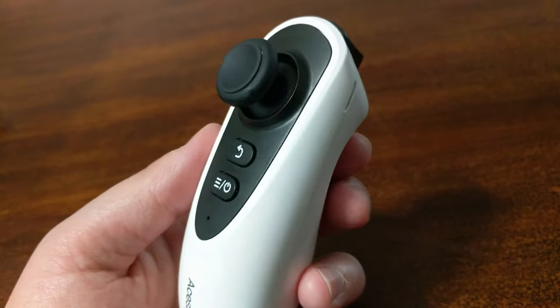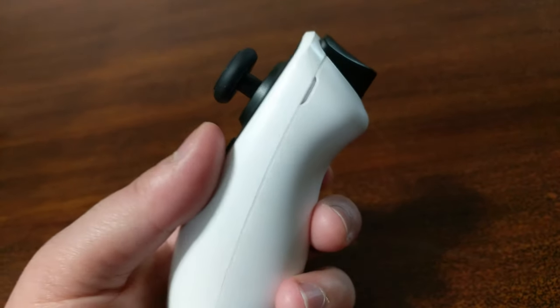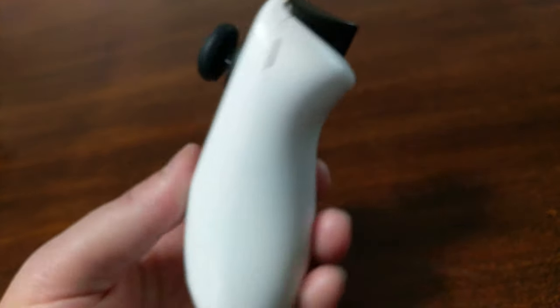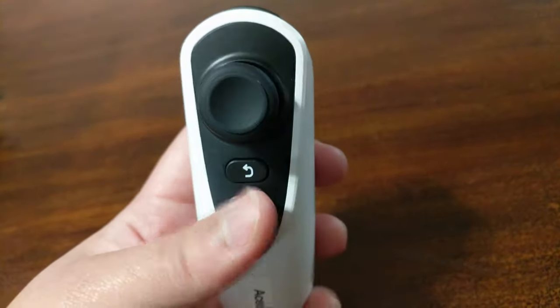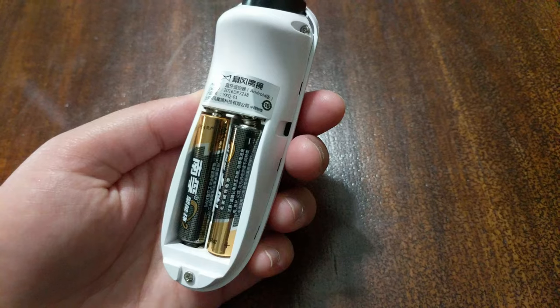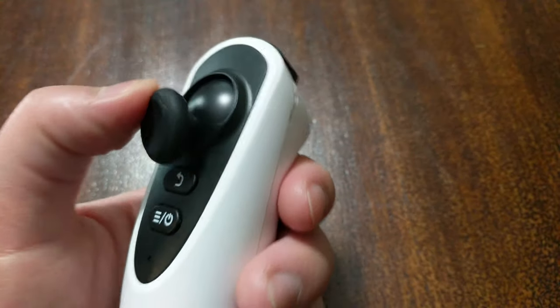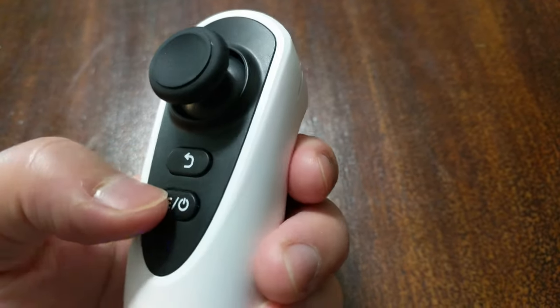This is the remote control that controls all the functions of the device, and to turn this on, you want to press and hold that bottom button, and it should pair automatically to your device. The remote uses two AA batteries. It has a joystick, and when you move it up, it zooms in, and when you move it down, it zooms out.